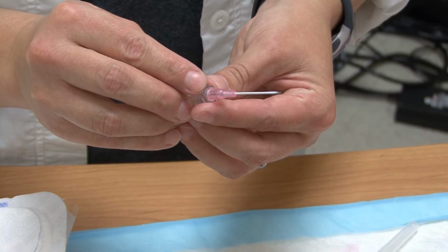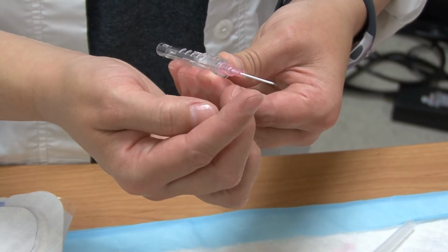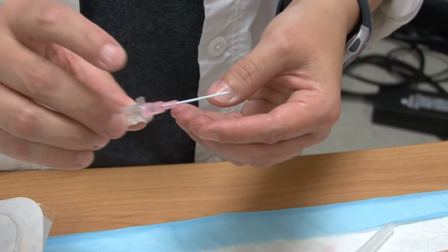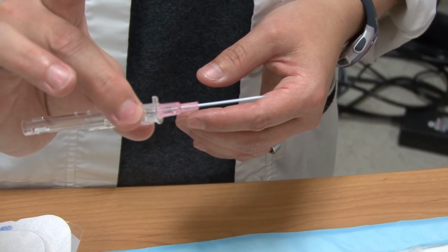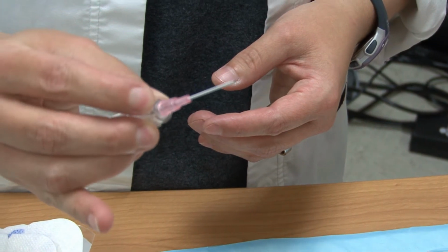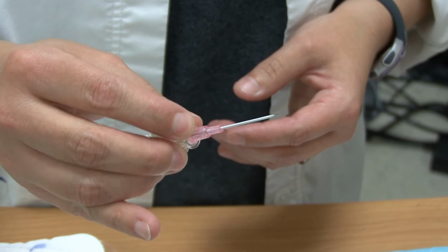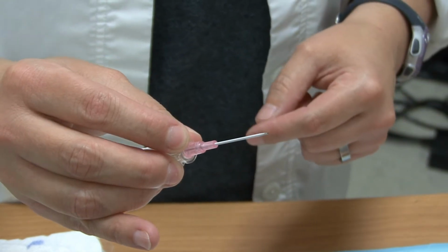You also do not want to let the actual IV catheter go over the end, because the needle could pierce the catheter and cause it to break inside of your patient. When I hold my IV catheter, I hold it with my thumb and my middle finger, and I put my index finger on this piece here, because this piece is what advances the catheter. I like to hold back on it so that the catheter doesn't migrate down the needle.